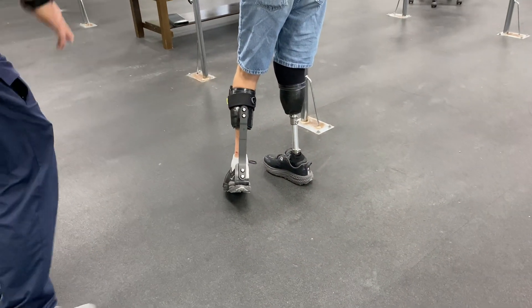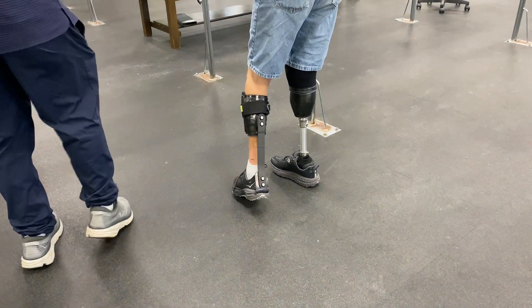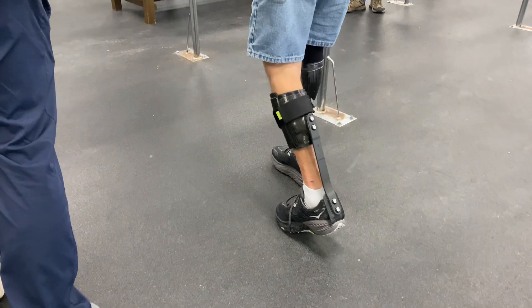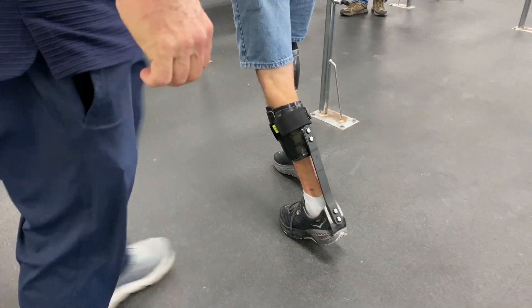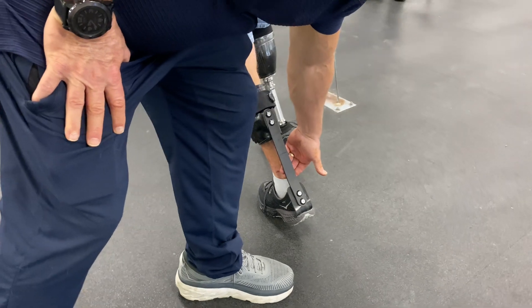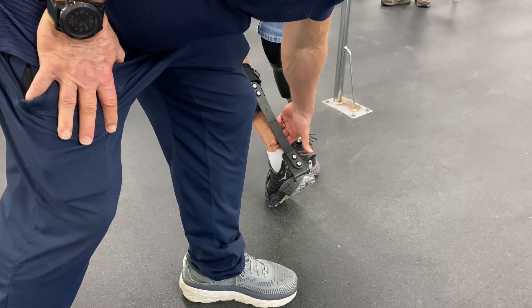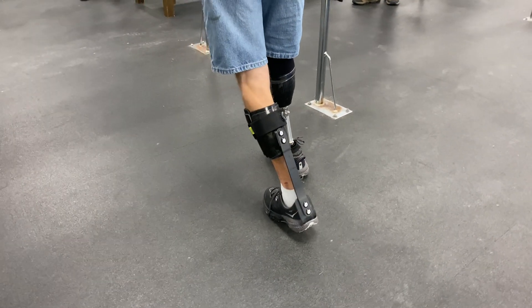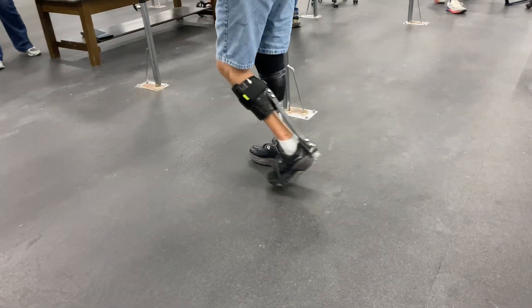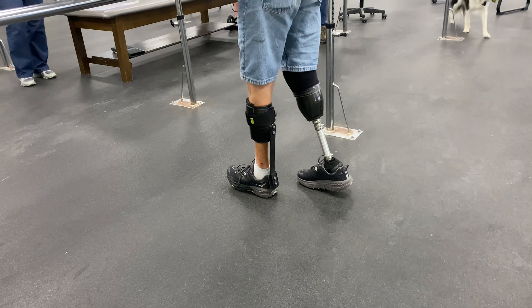That straightening is what's storing the energy and releasing it. If you do just that on your toe — and remember he's a partial foot — you see what I mean? The distance has really increased. I let it go and now it's closed back up, and that's the energy being released. It's amazing, because usually we see total stiffness.